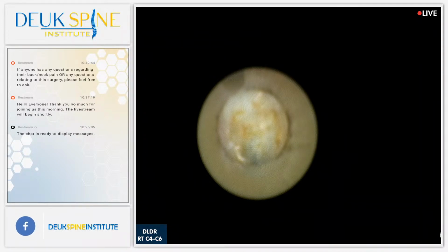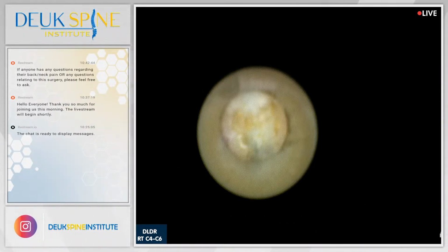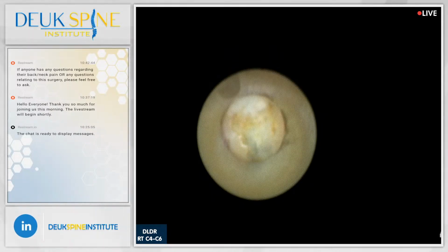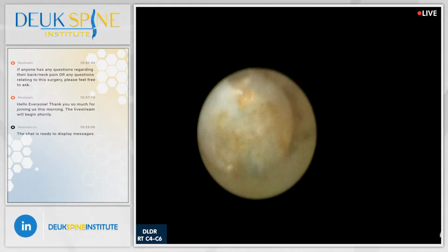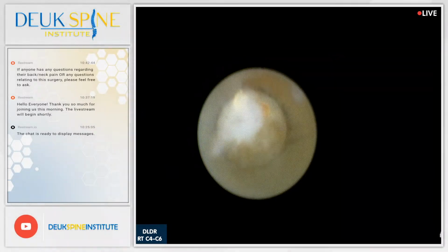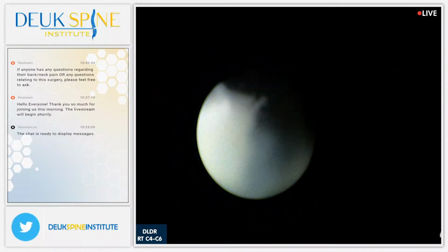Any questions from our audience? At this moment, no current questions. All right. This is another herniation. A lot of scar tissue holding these herniations in. That's why you need the laser.